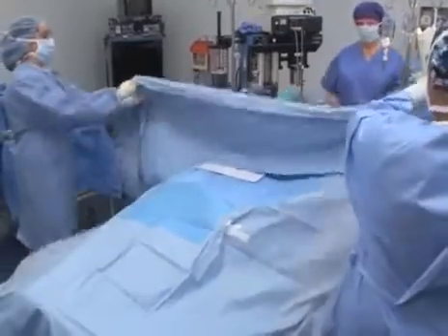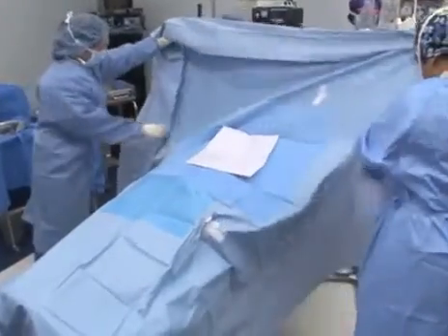The draping routine for a surgical procedure is a construction process. Layers of drapes are positioned over and around the surgical site in a particular order and orientation.